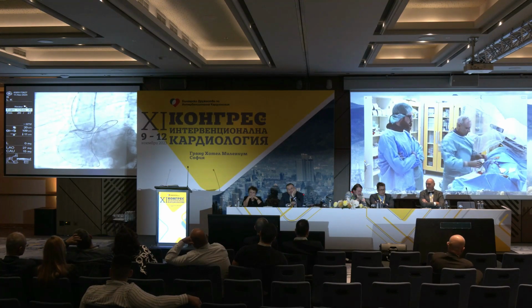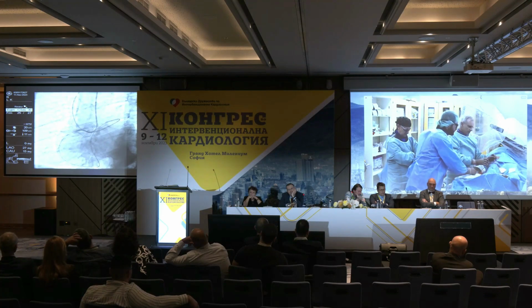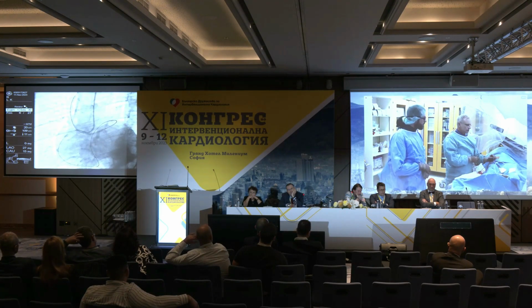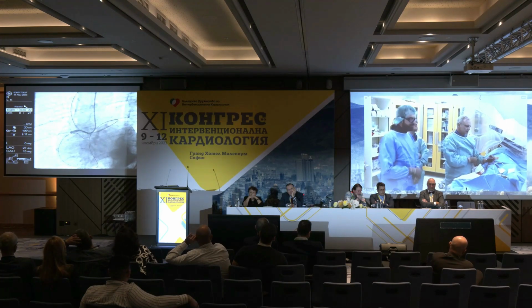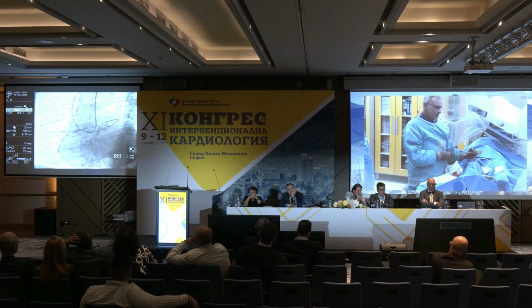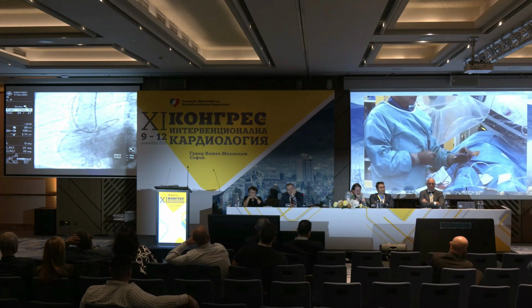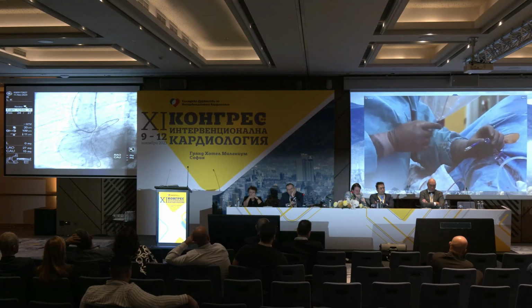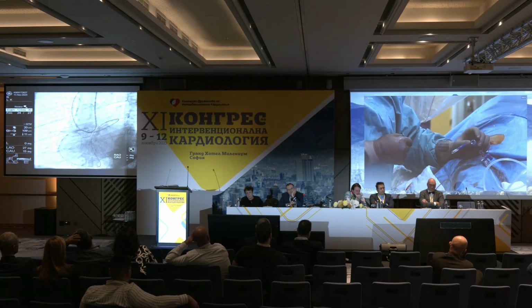But we have a problem now that, first of all, I'm running out of, can you focus a little bit on my hands, please? I'm running out of microcatheter, that's point one. The second thing is that all the problem in this occlusion was coming from two facts. First of all, that the vessel is big with a blunt cap, which I didn't know where to puncture, and the fact also that this proximal cap is severely calcified.